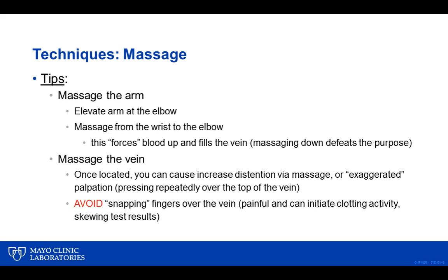One technique that I see a number of people doing is snapping with their fingers, particularly people that start IVs. What they're doing is literally agitating that smooth muscle of the vessel and causing it to react, and it makes it easier to palpate, it makes it easier to see, and in reality, we should avoid doing that.